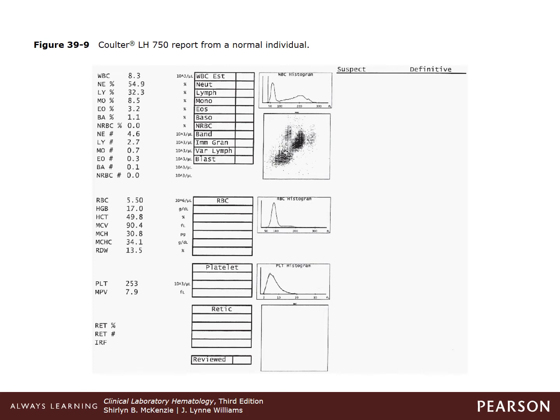The third aliquot goes into the orbital mixing chamber, which determines our 5-part leukocyte differential using a volume conductivity scatter flow cell. This flow cell only uses one cell at a time and detects one cell at a time, which is called hydrodynamic focusing. As each cell passes through the flow cell, there are 3 separate measurements taken that determine volume, conductivity, and light scatter characteristics. And the scatter plot is determined here.